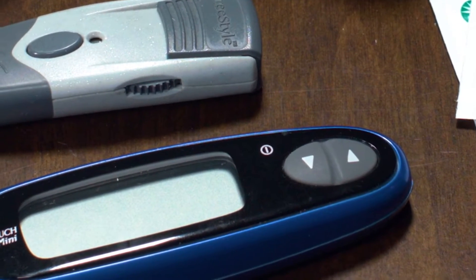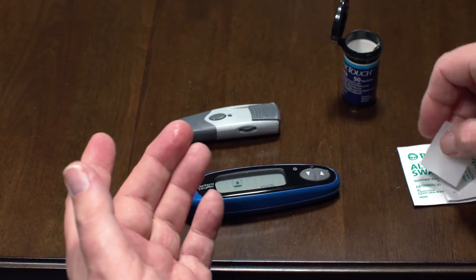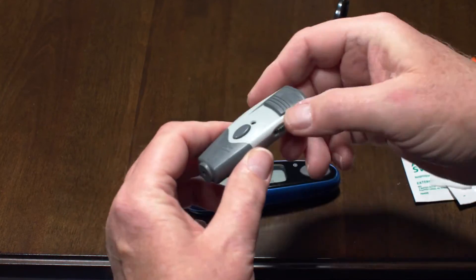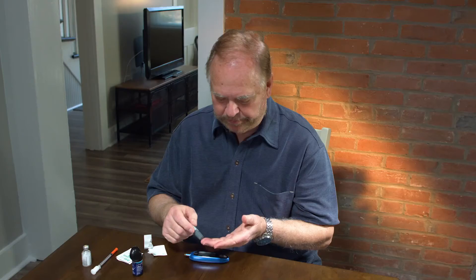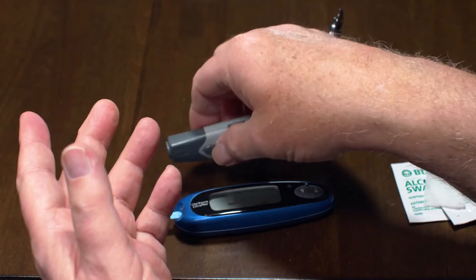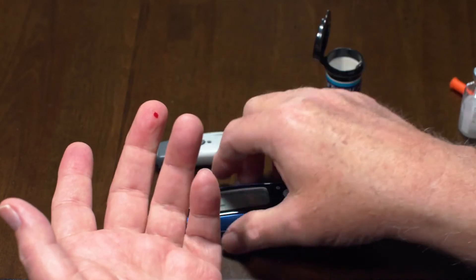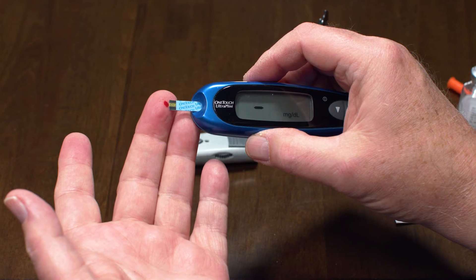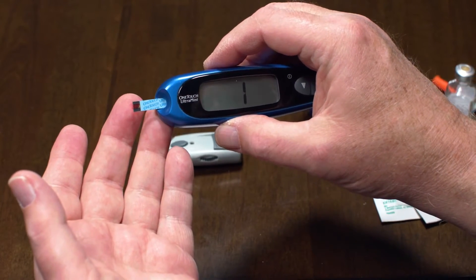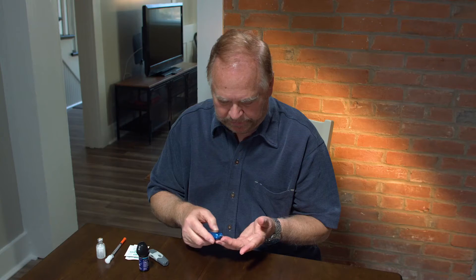You will first need to measure your blood sugar level with a blood sugar meter. First, lance your finger to produce a small amount of blood. Put a drop of blood on a test strip and insert the strip into the meter. This measurement will tell you if your blood sugar levels are in the normal range and how much insulin you will need to control blood sugar levels around meals.